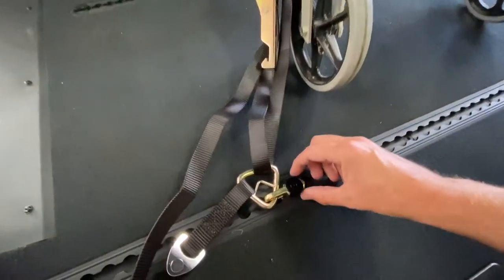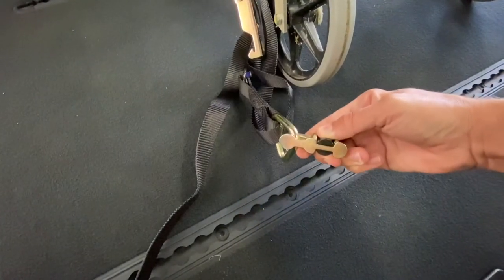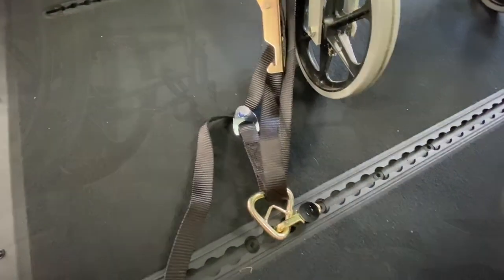To move the tie-down, simply pull up on the black lever and move left to right in a pull-up motion. To put it back in place, line up the L-track, push down, and move left to right until you hear a locking noise.